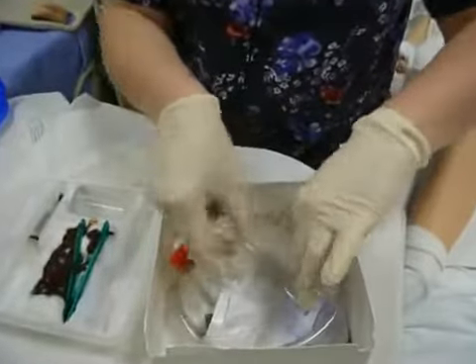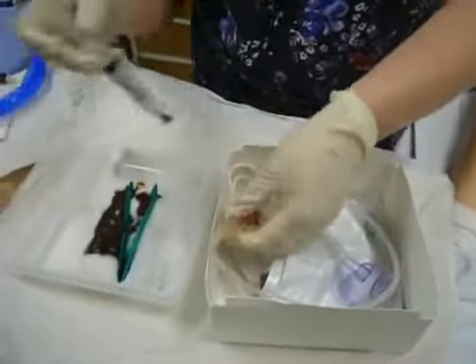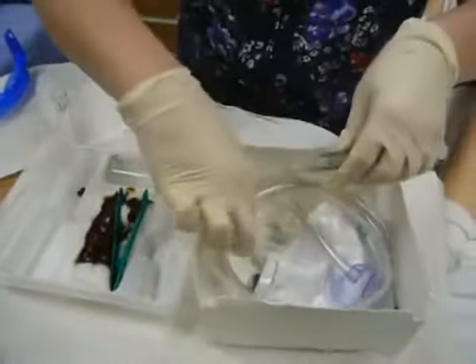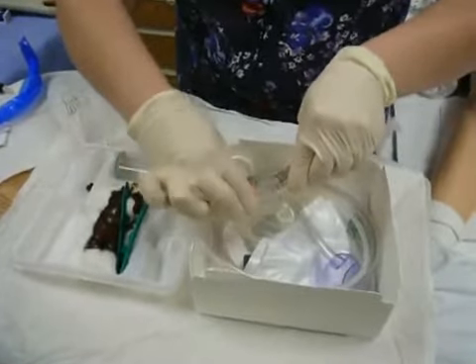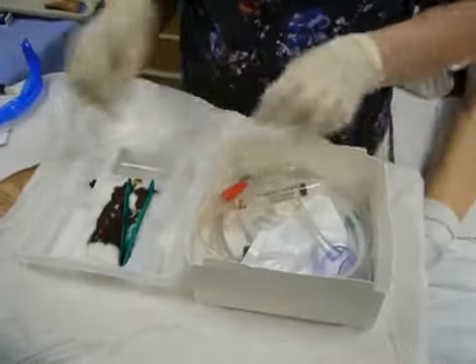Once I have that ready, I can put this back in. I don't want it flopping around. I want it to be safe. The last thing I need to do is take my sterile water syringe, and make sure that I connect it to my pigtail here, which is the balloon insertion port right there. I do not have to test my balloon because this is a Bard catheter, so I don't test my balloon.